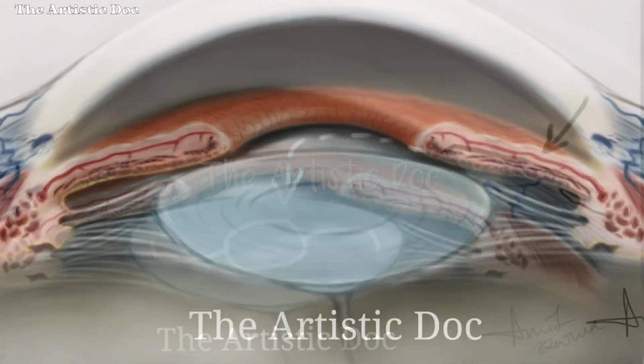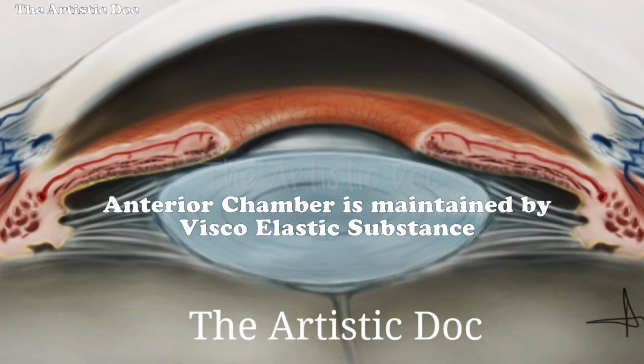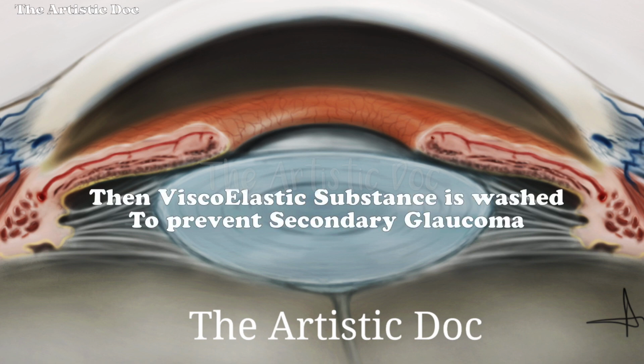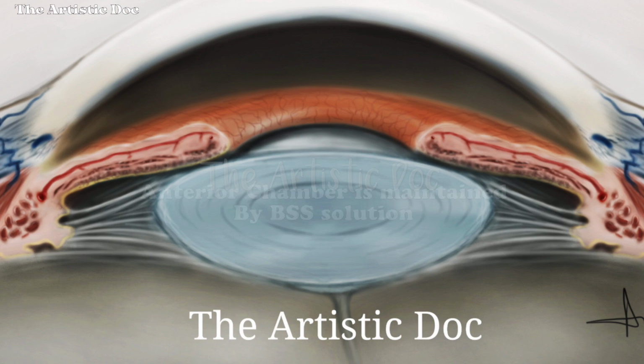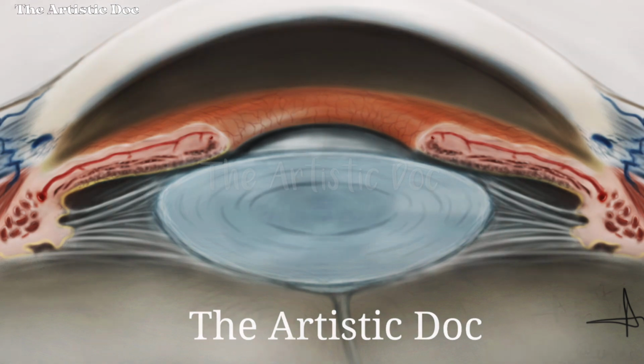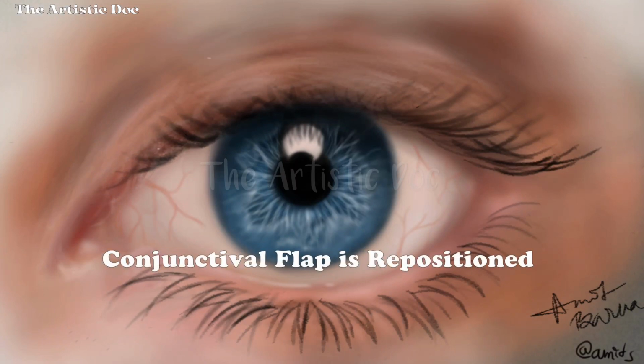Now the anterior chamber is maintained by viscoelastic substances. Then the viscoelastic material is washed thoroughly to prevent secondary glaucoma, and at the end, after maintaining the anterior chamber with BSS, the wound is closed, and the conjunctival flap is repositioned.